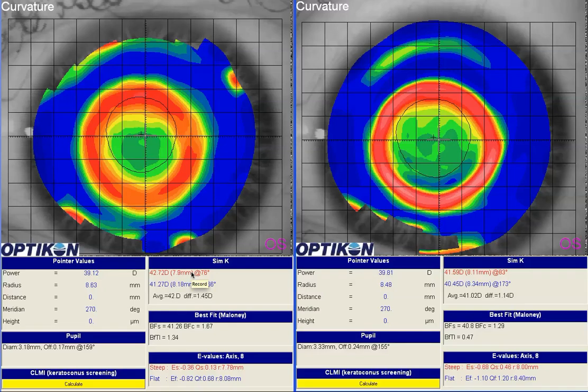This is an orthokeratology case where the patient is still a little bit undercorrected after wearing lenses. We have two different posterior topographies. The patient had some complaints of flare at first also, and so the second lens was designed with a larger diameter and also a larger treatment zone. The new posterior topography really looks fantastic, very well defined treatment zone. It's bigger than we initially had.